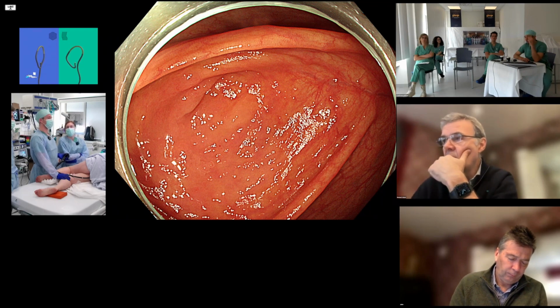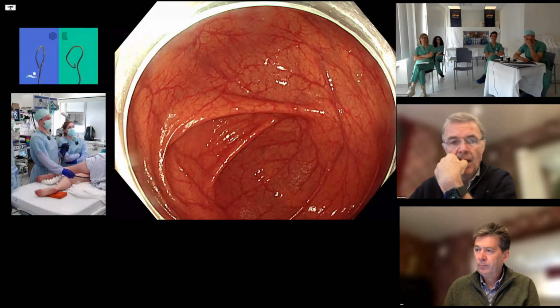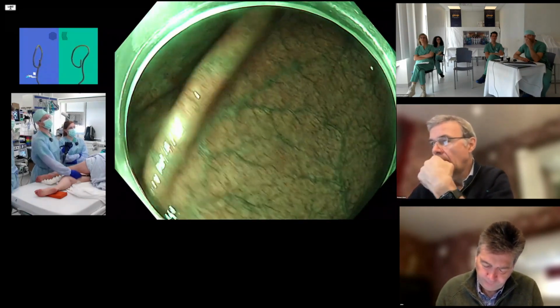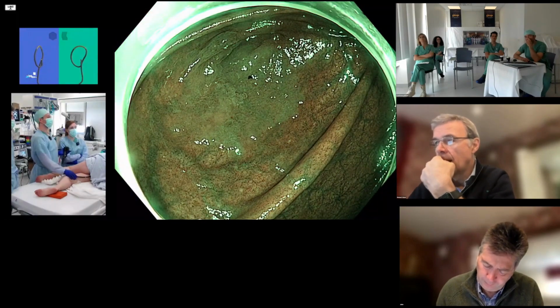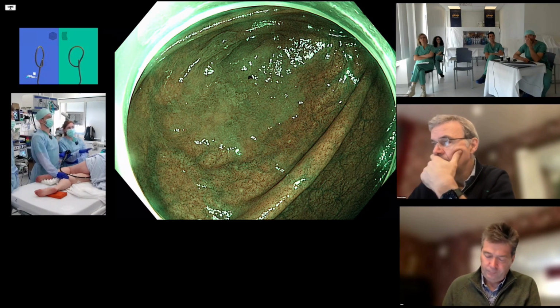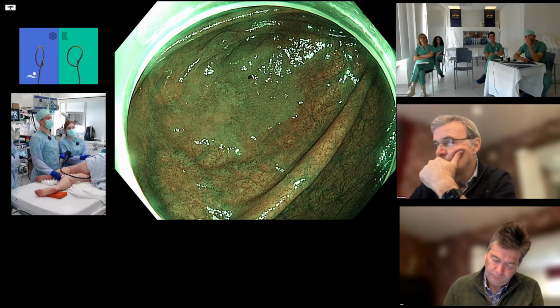Xander, I can't see a polyp. But Xander, there was another question. You're ahead of the story. So you were looking at the orifice, but there was a question before that. Everybody, before they go to sleep, we want to know if they have a polyp at the appendiceal orifice. What do you want to know? If she still has an appendix, and she has had no appendicectomy, so she has, in fact, an appendix.